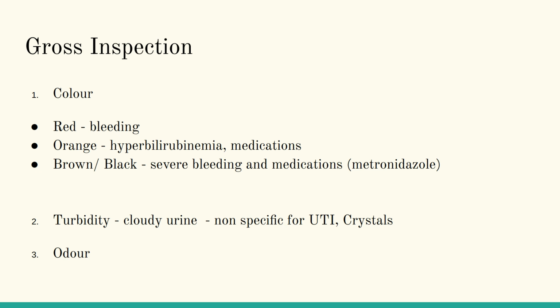Turbidity is the presence of cloudy urine. This is a non-specific marker for urinary tract infections or UTIs, and for presence of crystals in urine.